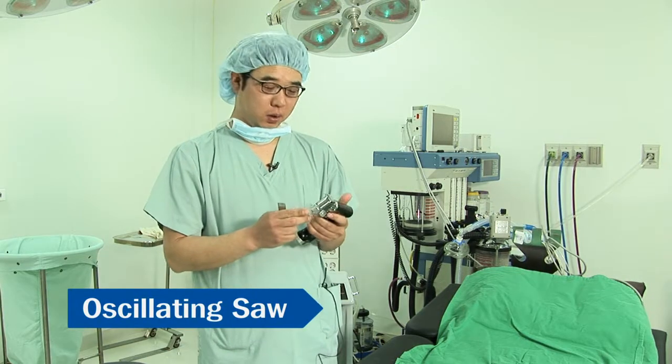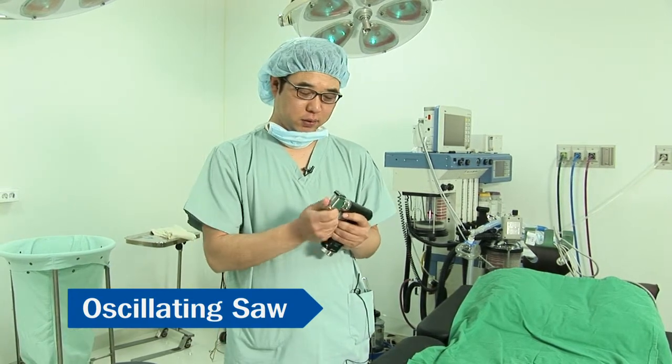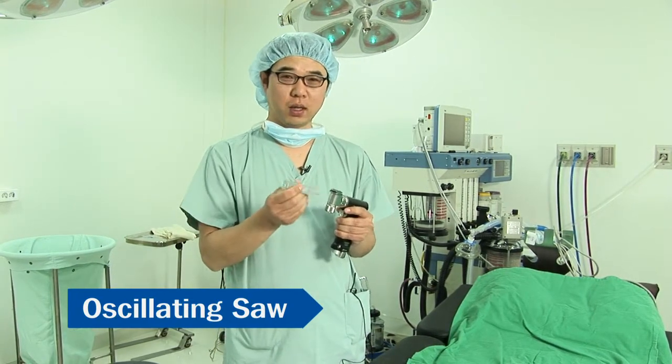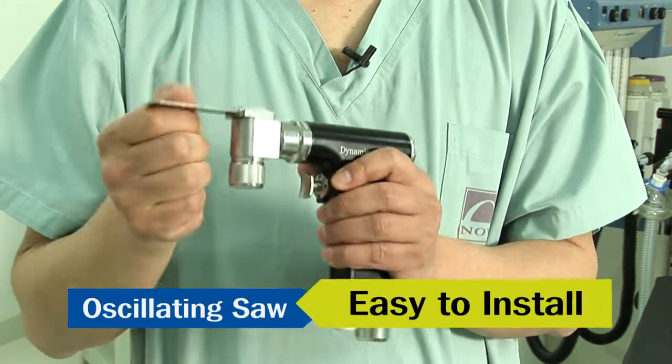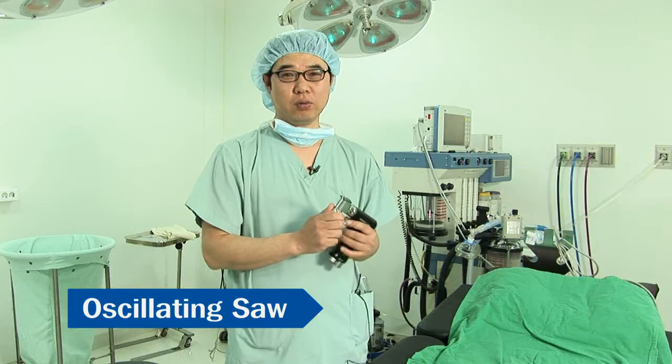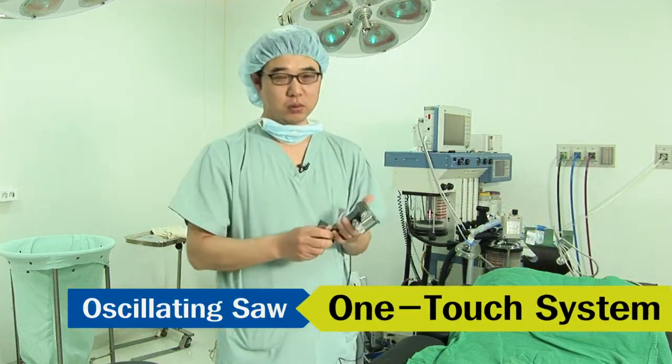I will use the dynamic oscillating saw to perform surgery. First of all, it's easy to attach. When connecting the blade, it's very simple and easy to replace the blade with a new one or another instrument. It uses the one-touch function so it's very convenient.